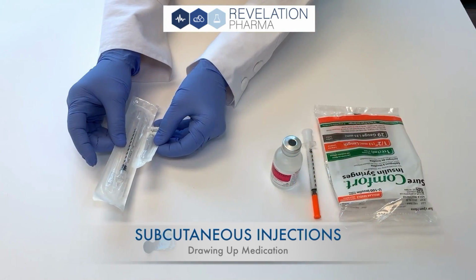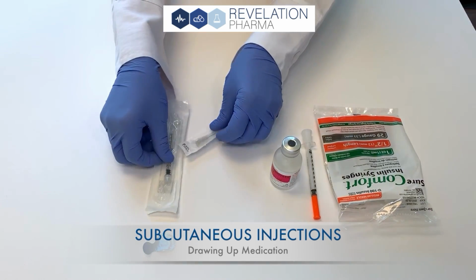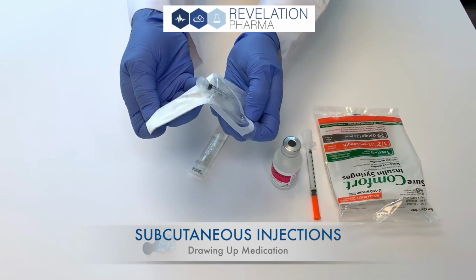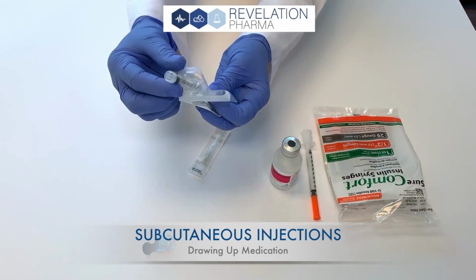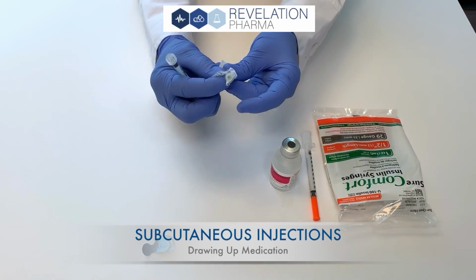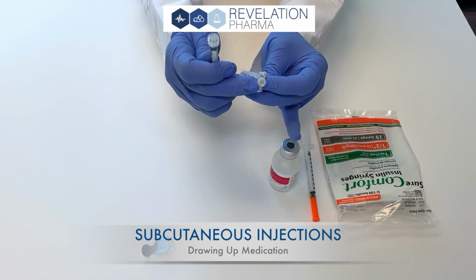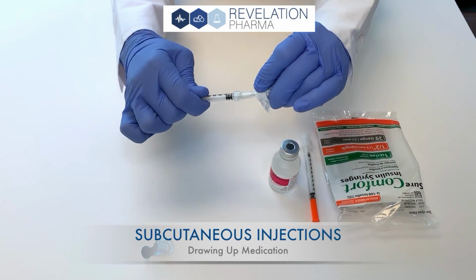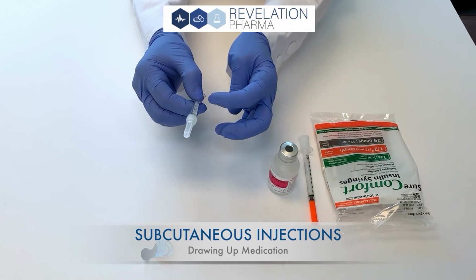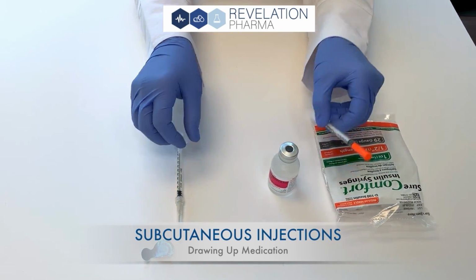If you are given separate needles and syringes, you can simply assemble the syringe like this. Be careful not to touch the parts of the syringe and needle with your fingers. That's the sterile part. So you can assemble your own syringe if you were given two different pieces. Your syringe should look like this.